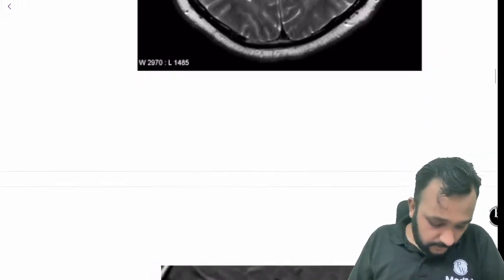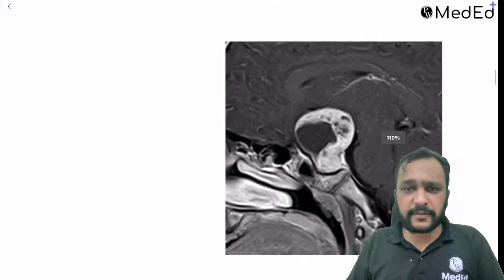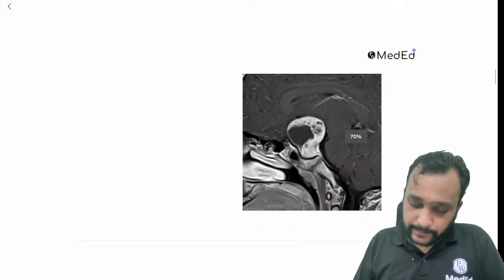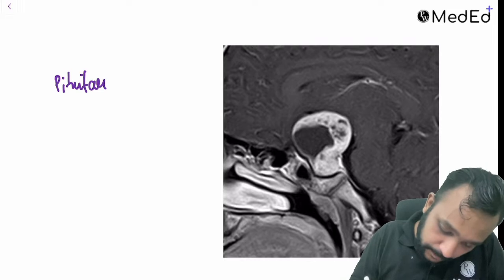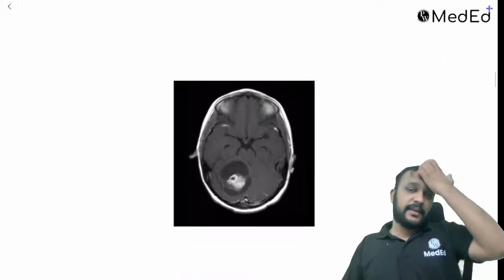So now guys, this is the figure of 8 appearance. Very simple question. So this figure of 8 appearance is shown by a case of pituitary macroadenoma, right?